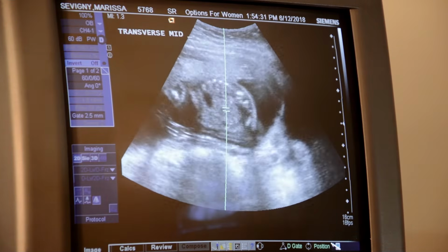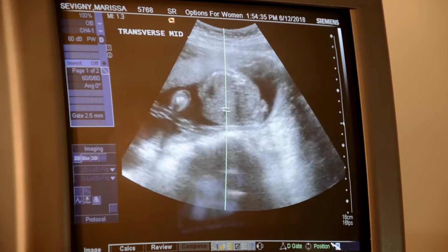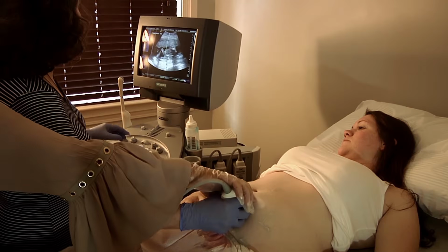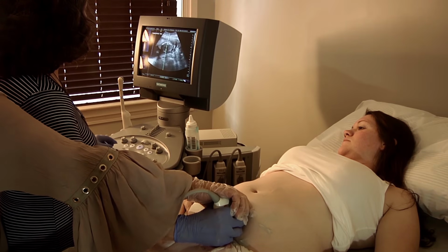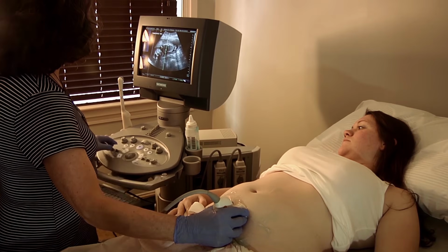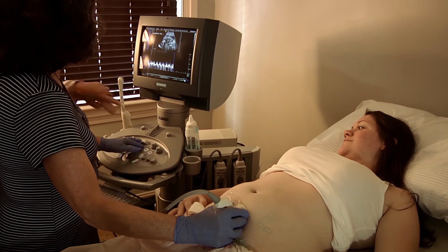Okay, first you've got to find the heart, and then you put this cursor through the center of the heart, okay? Right, there's the heart, okay? Now hold that there. Then hit your D again for Doppler. Okay, now hit freeze. Good.